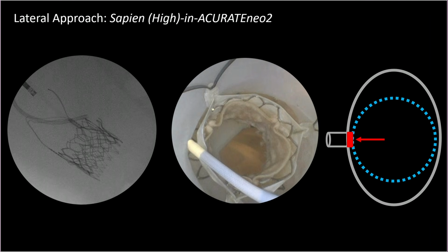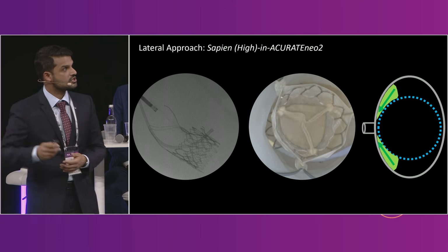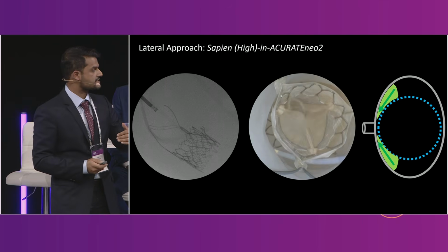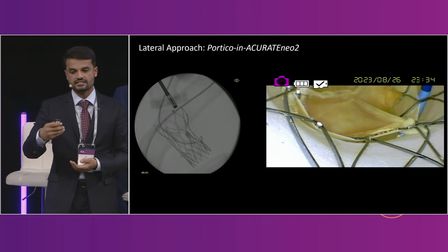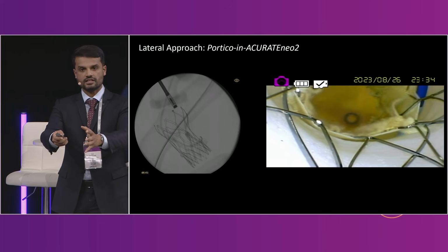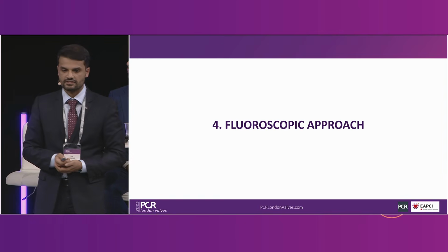So this is a redo TAV, high neoskirt situation, you can't access. But if you simply go laterally, you can use the open cells of the Neo's arch to drop into an adjacent sinus and essentially circumnavigate your way around the assembled valve complex in what is a lateral approach. Even in this setting, this is a very challenging. We've got two tall frame valves, two self-expanding valve platforms, so many barriers here in the middle, but you can simply navigate around using different catheters.